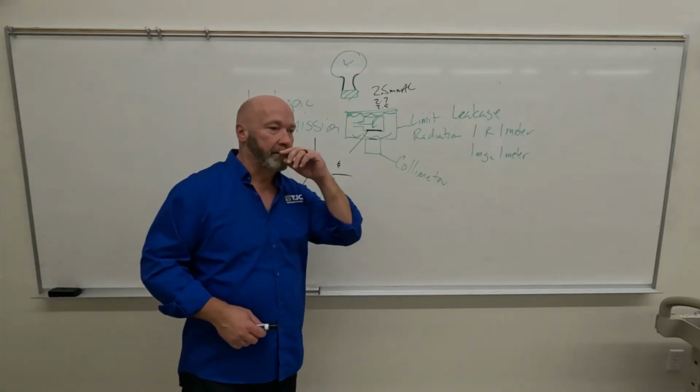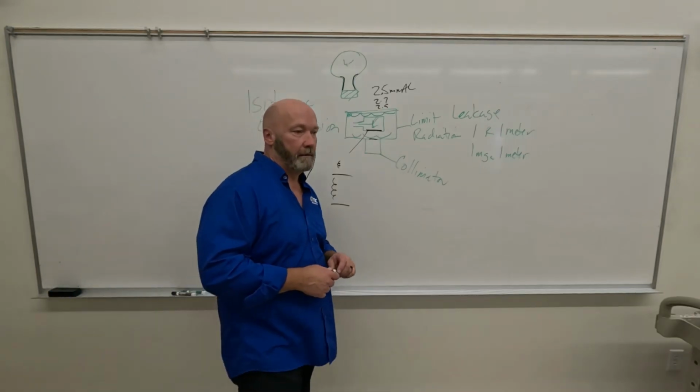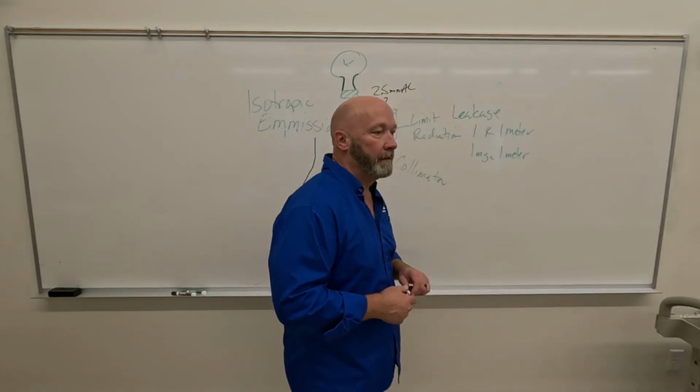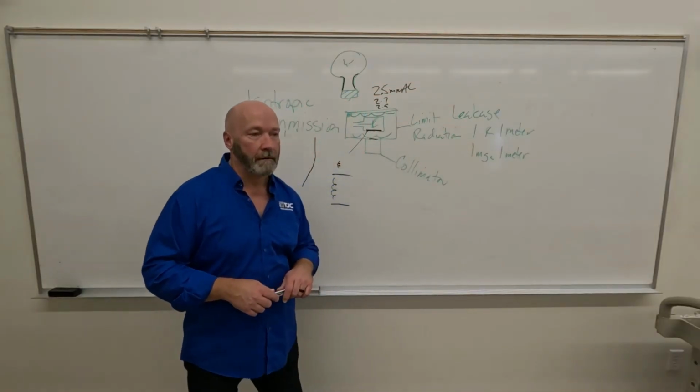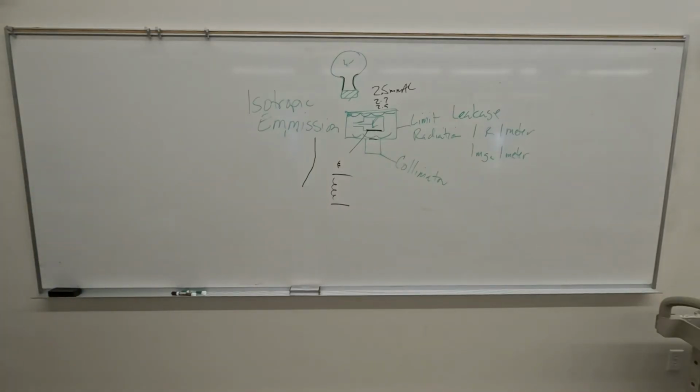So you had a question? Yes, earlier you said there was an alloy with tungsten and then it was thorium or? Thorium. In the book it says a different metal? Rhenium. Oh, yeah. Thorium. I think I've got them backwards. Thorium may be the anode. Rhenium. So what is thorium?